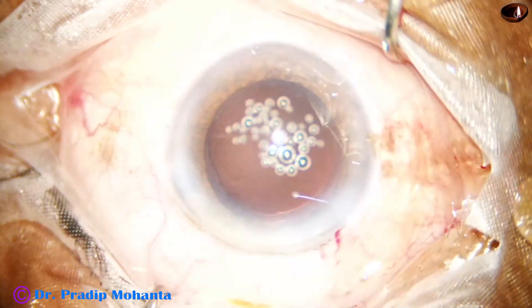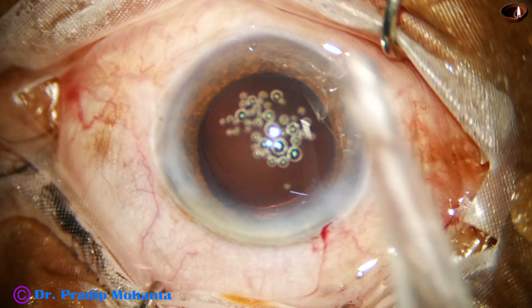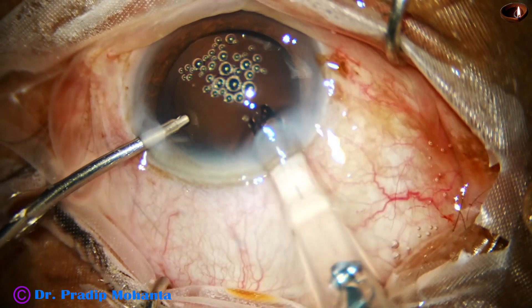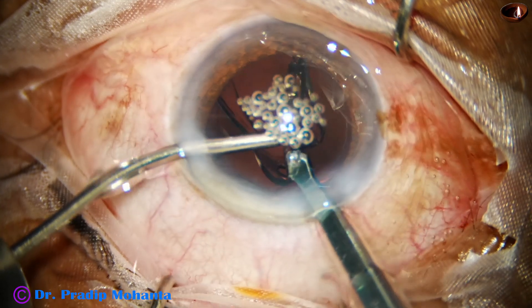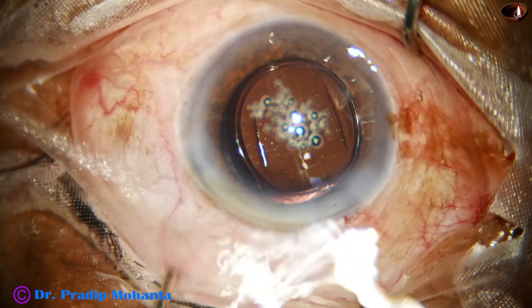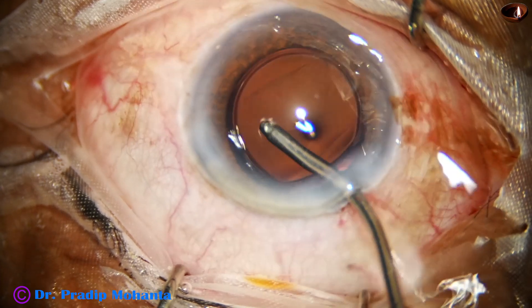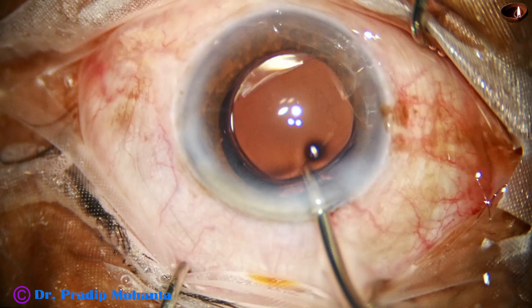And now it is the time to implant an intraocular lens. The anterior chamber is formed by BSS and the lens is injected and placed in the bag by the left-hand instrument — in this case, the irrigating cannula. The irrigating cannula is then used to wash out and replace the air bubbles.